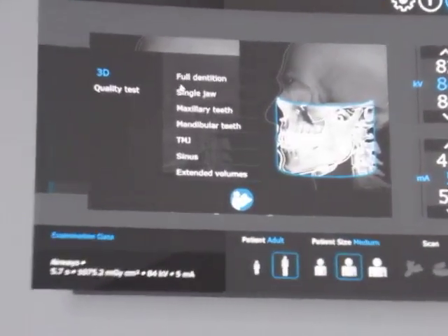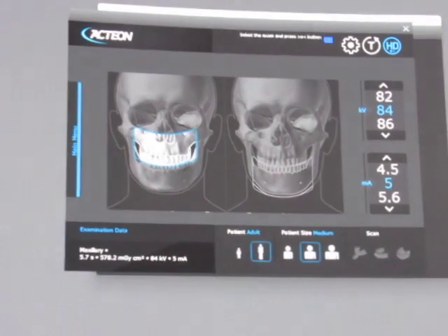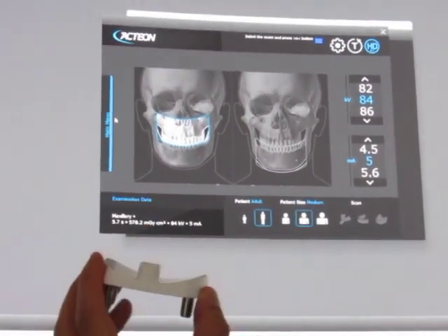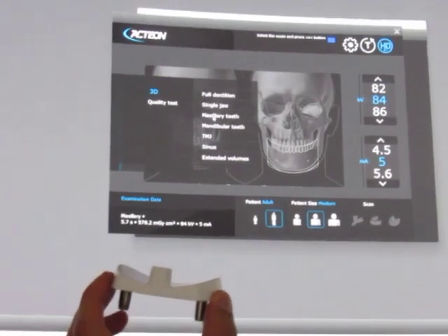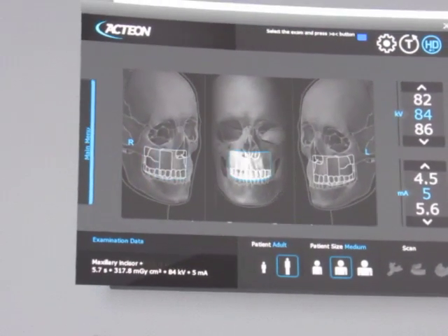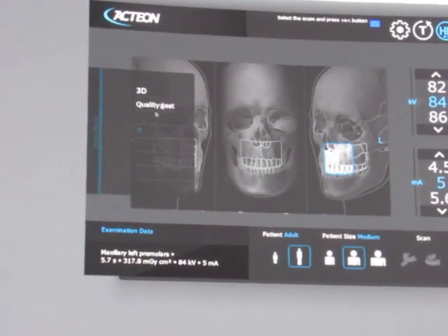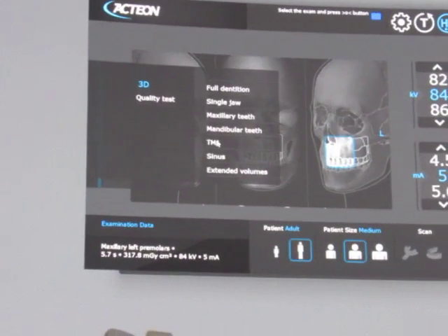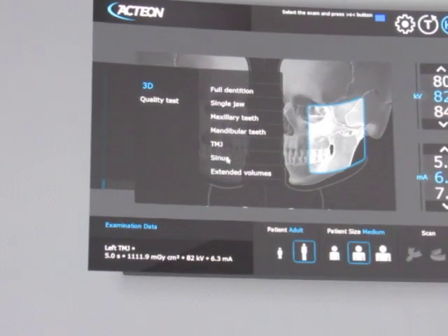Next, for single jaw maxillary, you'll use your small chin rest. You will also use this for your maxillary shots, and again, there's five of them. You will also use this small chin rest for TMJ and your sinus shots.